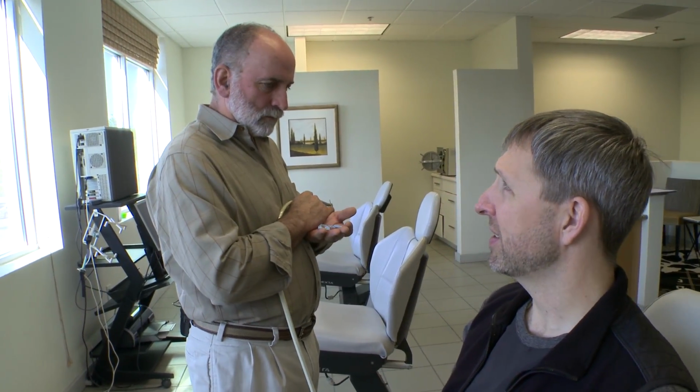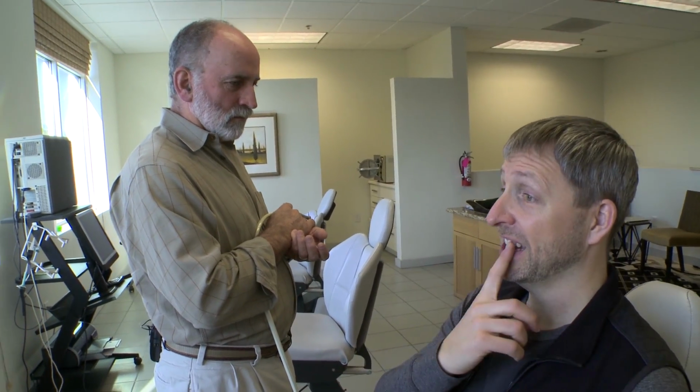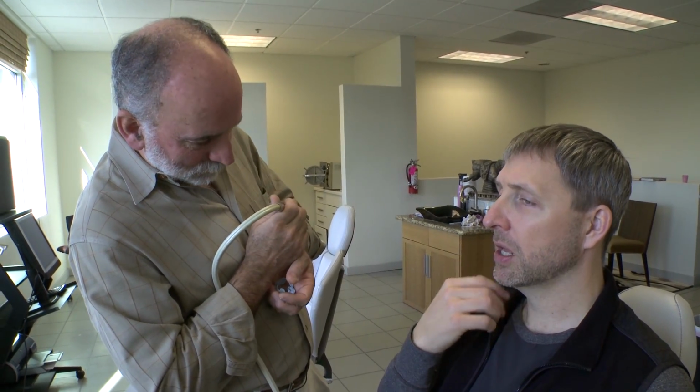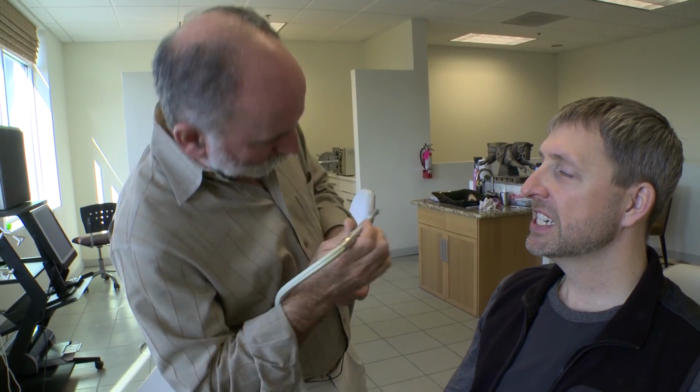You're taking off less than 10,000th of an inch when you do that, right? And I can totally feel the difference. It hits here, then it hits here, then it hits here. And when it feels right, I'll be able to tell you, because I'll feel my molars hit and my front hit and not too hard. Right, exactly. Now the right's hitting. And I'm getting a little bit of back pressure now, which I want. Right. So it's right there. Okay. Good.